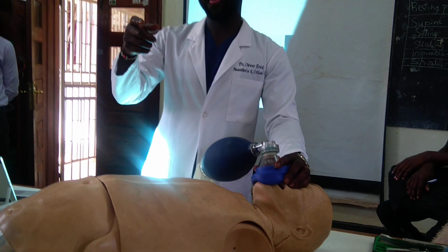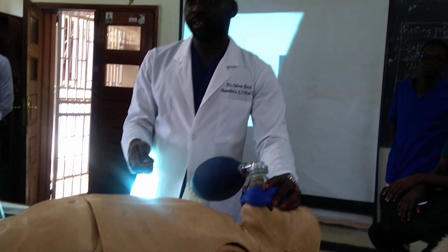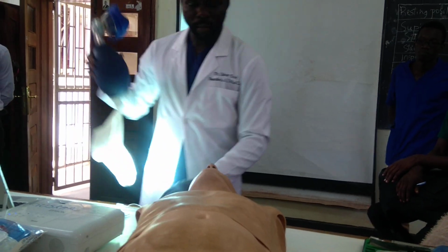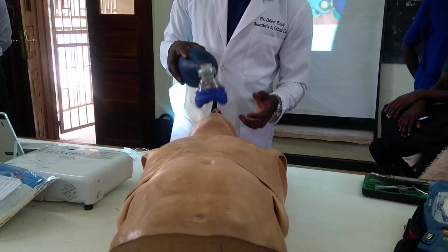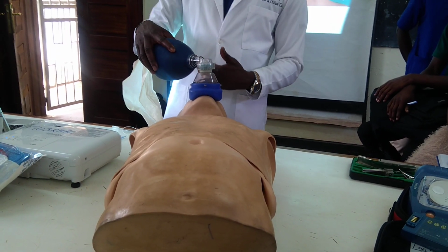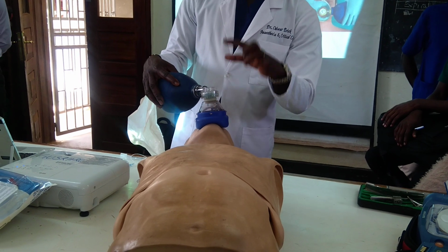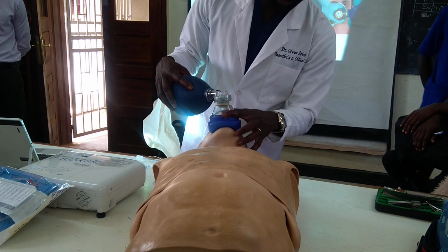Your name is? Xavier. You will kill a patient if you do this. Make sure you are always at the patient's head, just as I am right now. And then, assuming this is the right mask for the patient, you can also test. It covers nicely. I think the eyes are avoided, though it is slightly longer. But I can ventilate the patient using this and save a life. I'll grab this from here. This is my C. The E clamp comes here.